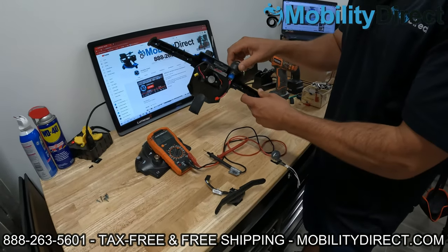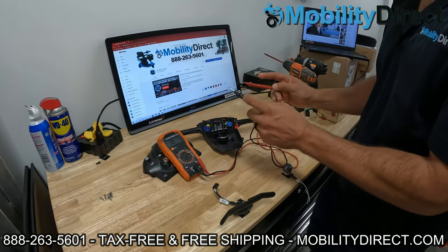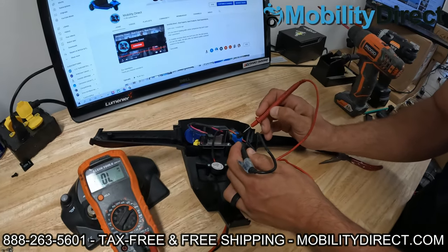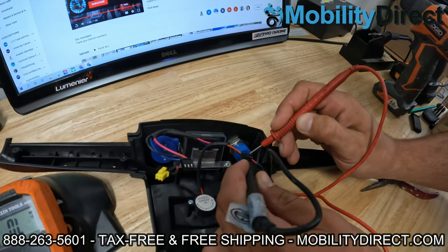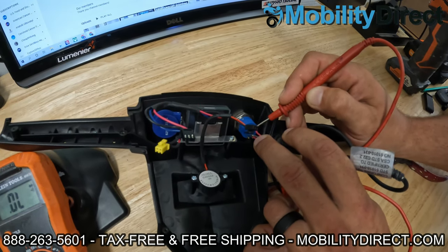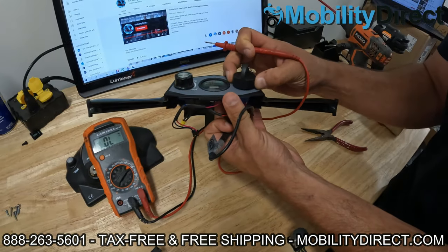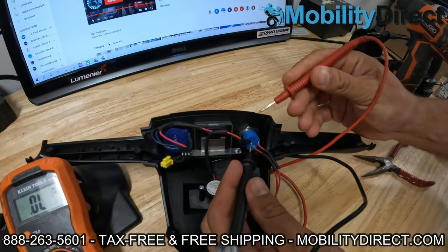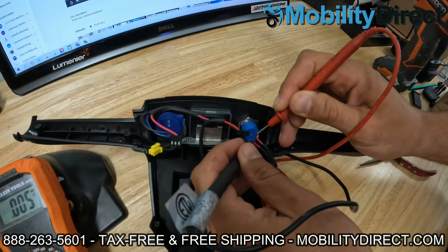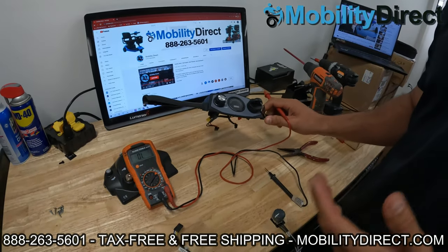Right now I've got the key in the off position — rotated counterclockwise. I'm going to test both ends of those probes where the red wires are going, and it should not beep. I've got them on the two little metal pads that it's soldered to and we're not getting a noise — that's normal. Now if I turn the key clockwise into the on position, we should hear a beep because the circuit is now closed and that's going to deliver power to the unit. And what do you know — we have continuity. So that means that this ignition is working as it should.